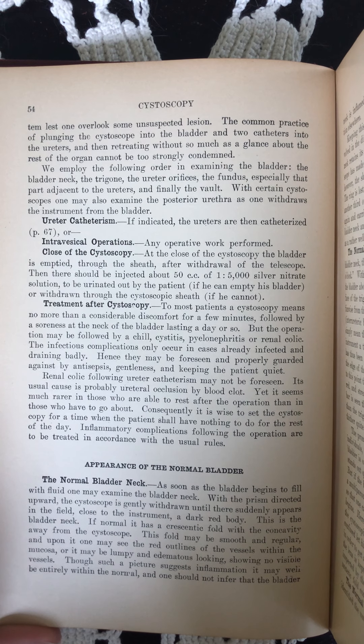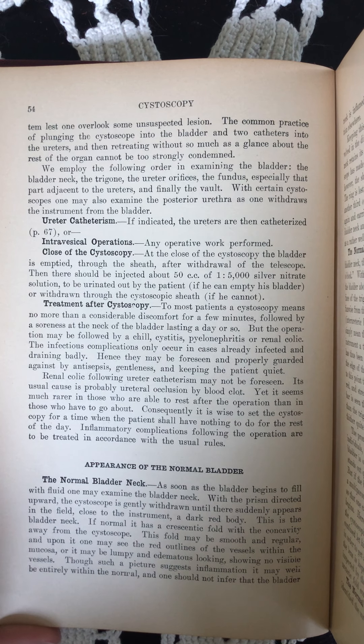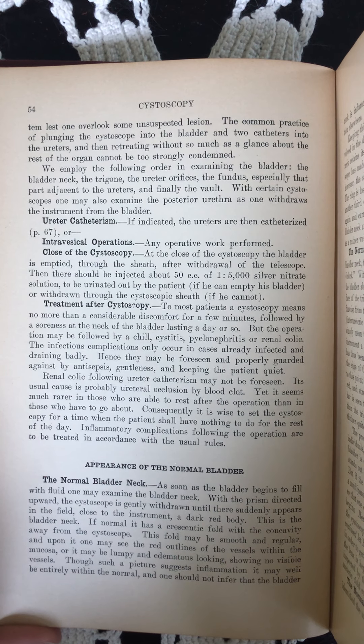We employ the following order in examining the bladder: the bladder neck, the trigone, the ureter orifices, the fundus, especially that part adjacent to the ureters, and finally the vault. With certain cystoscopes, one may also examine the posterior urethra as one withdraws the instrument from the bladder.